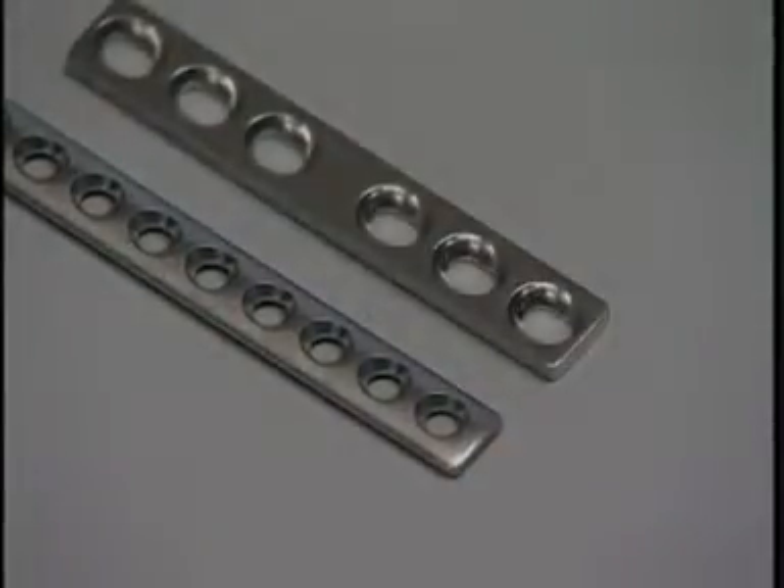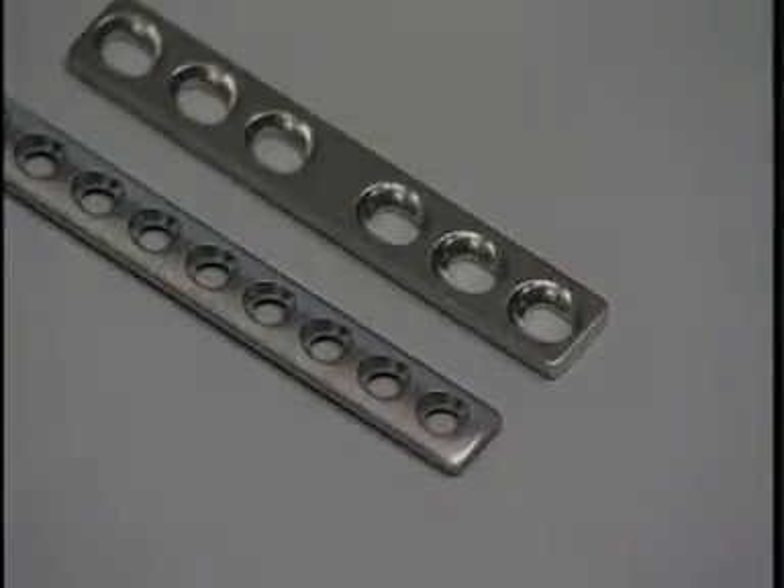An advantage of the cuttable plate over the 2.7 dynamic compression plate is that more screws can be inserted in the cuttable plate per given unit length.